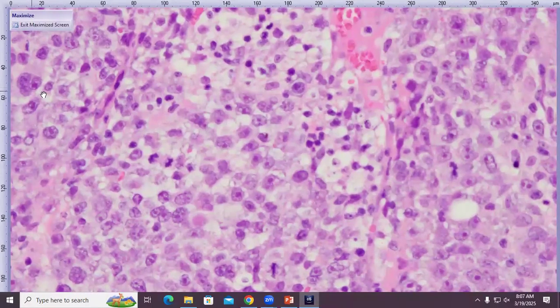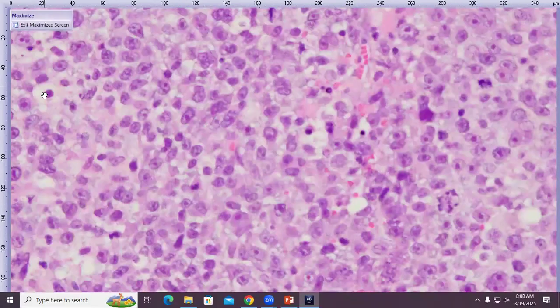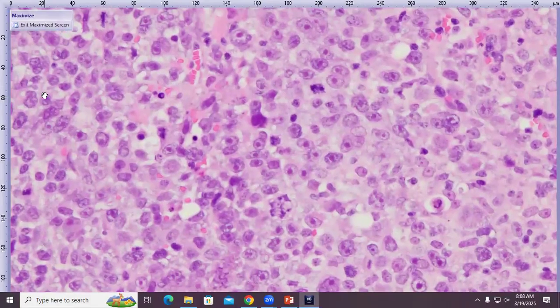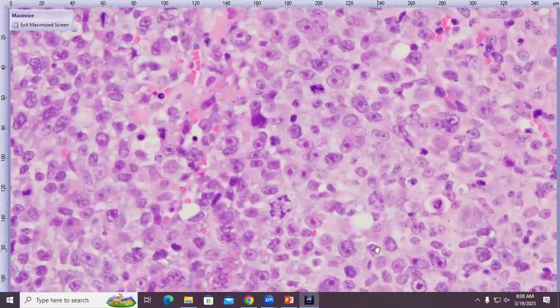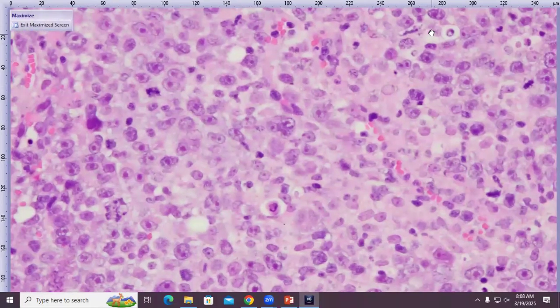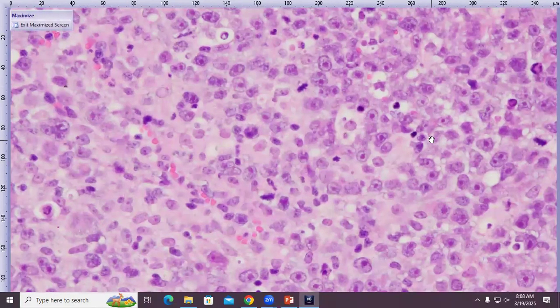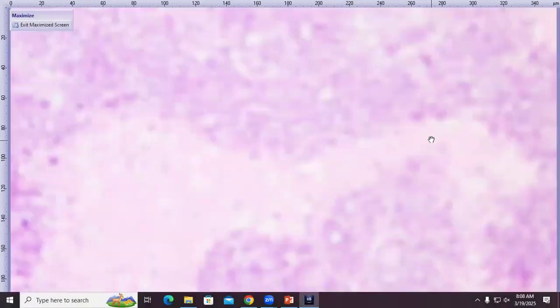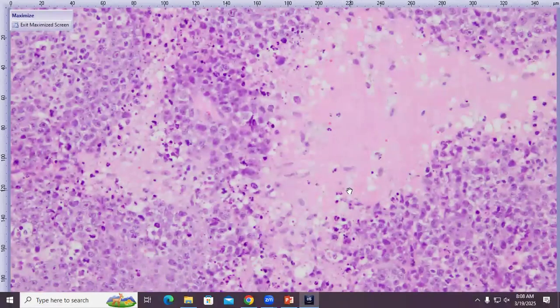Off in this corner, you can see a cell that is multinucleated. So there is quite a bit of pleomorphism here with at least moderate anisocytosis and anisokaryosis, differences in cell and nuclear size. In this field alone, we have 1, 2 mitotic figures, maybe 3. So it's fairly mitotically active, and this might be a really bizarre mitotic figure. So we have a very pleomorphic, ugly, malignant-looking population of round cells. And the areas of necrosis, as I said, are all pink. And so in here, we might start to see a little bit of pyknotic nuclear debris and some ghosty, eosinophilic outlines of necrotic neoplastic cells.